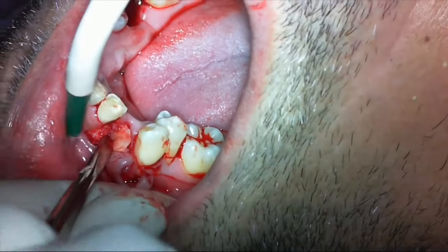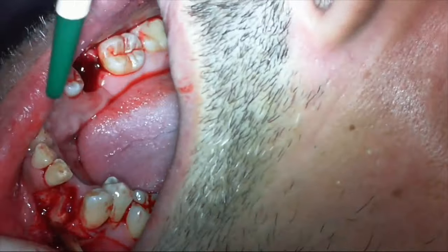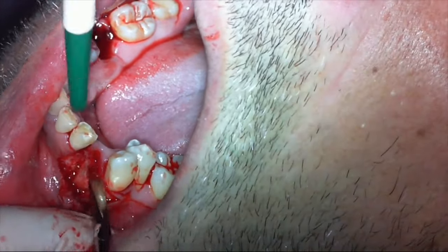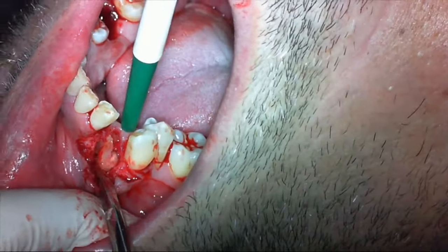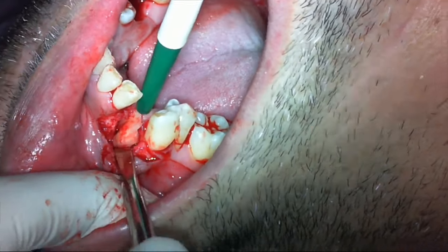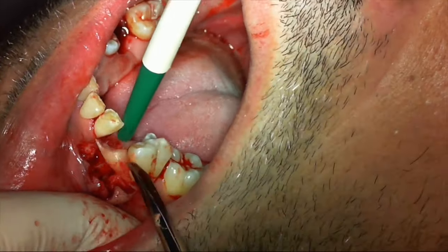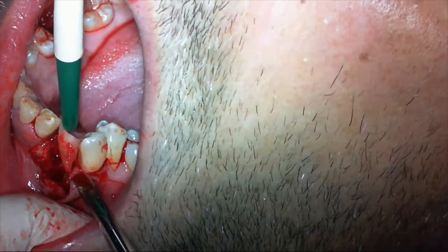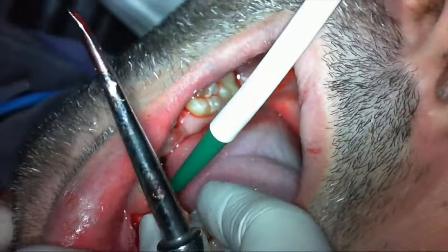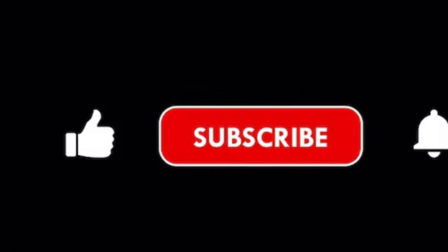Because it's very thin, you're not removing much bone — you're cutting more at the expense of the root than the bone. Then using the luxator in a clockwise and anti-clockwise direction, the root will tell you which direction it wants to exit. Once you see some movement, you increase the rotation in that direction. As you can see, it's double-rooted.